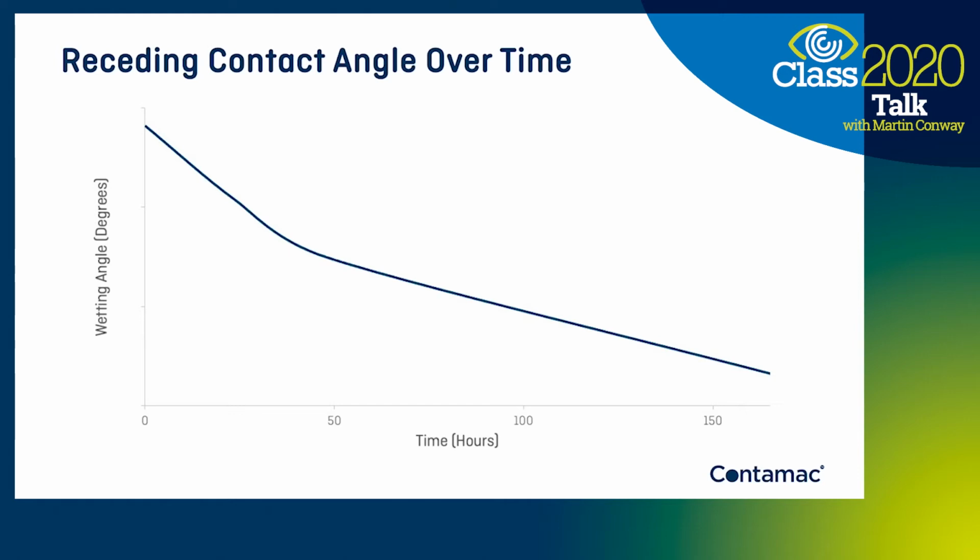If not, you will find the patient will complain, particularly if it's a replacement lens, that the lens doesn't feel as good as his old lens, or it may even require extra cleaning during that first week or so, as the surface is drier and will tend to attract more deposits. So this conditioning process is essential. And you can see there the quite dramatic differences in the wetting angles that tend to occur after 7 days or so. Now, this occurs to all manufacturers' materials, so it's not particular to one type of material or one particular manufacturer. So as you can see here, although it takes 7 days, the majority of the change occurs in the first 48 hours.